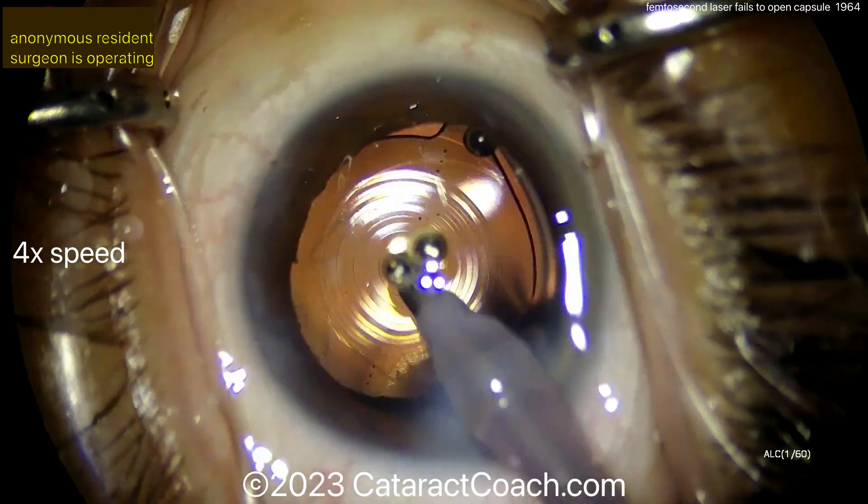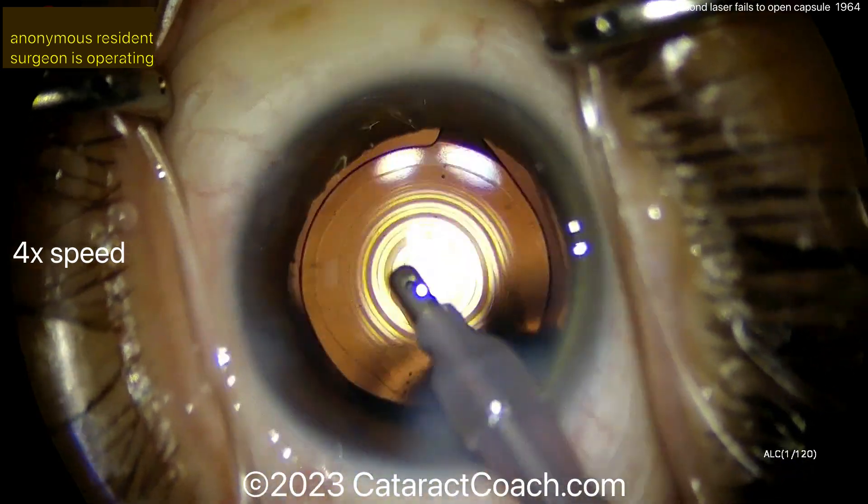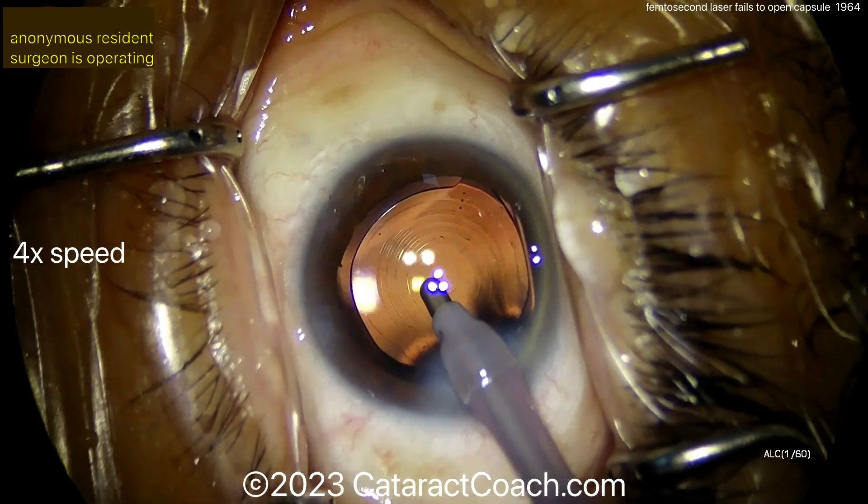Remember: learn how to use all these tools. Femtosecond lasers are great, but do you really need them? And if they don't work and they cause an issue, can you — like this young surgeon — recover successfully? Beautiful case. Thank you.